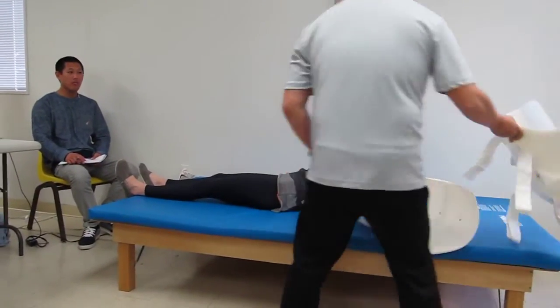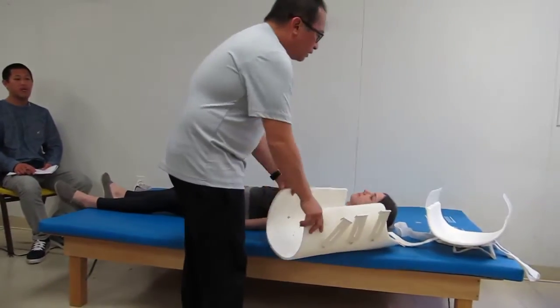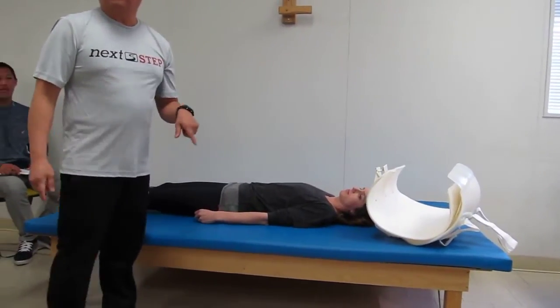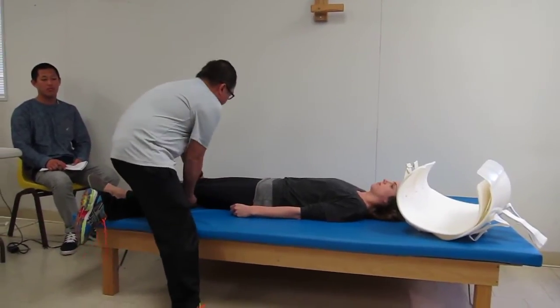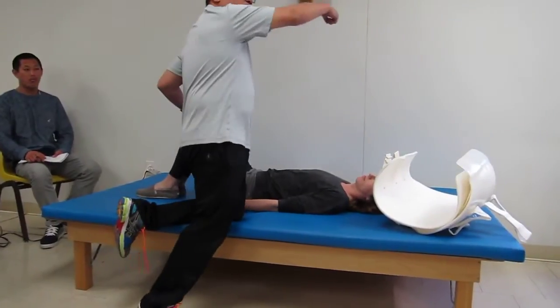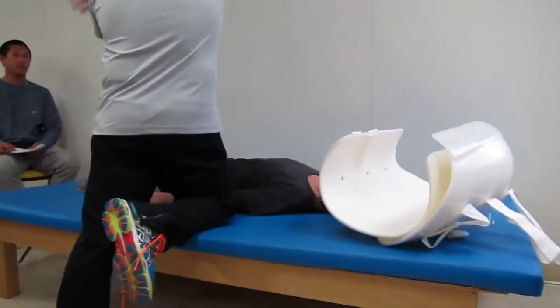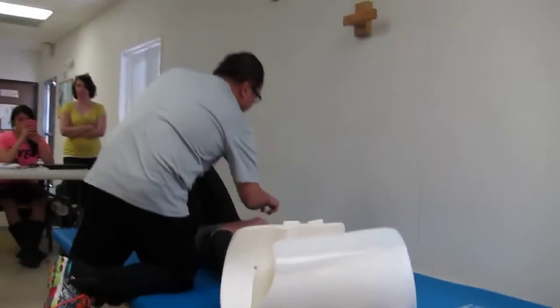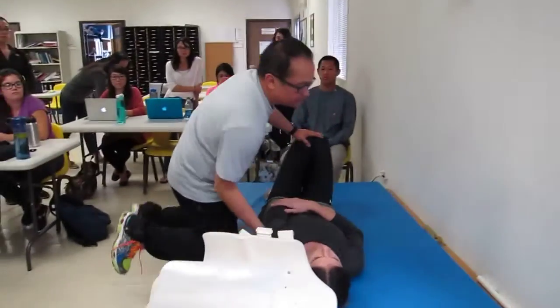Okay, cool. Megan, go ahead and lie down. We're going to do a couple of log rolls in order to get the TLSO on. Again, Megan, I'm going to bend your knees. Now I'm going to roll her over to that side, because I'm on this side of the bed, that's the only reason. Let's fold your arms, thank you. I'm going to roll you over to the right side.